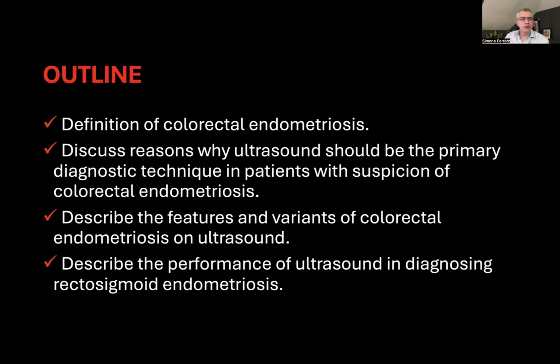During this presentation, I will provide a definition of colorectal endometriosis. I will discuss the reason why ultrasound should be the primary diagnostic technique in patients with suspicion of colorectal endometriosis. I will describe the features and the variants of colorectal endometriosis on ultrasound. And finally, I will provide some information on the performance of ultrasound in diagnosing rectosigmoid endometriosis.